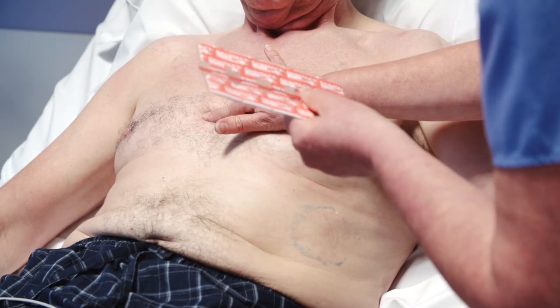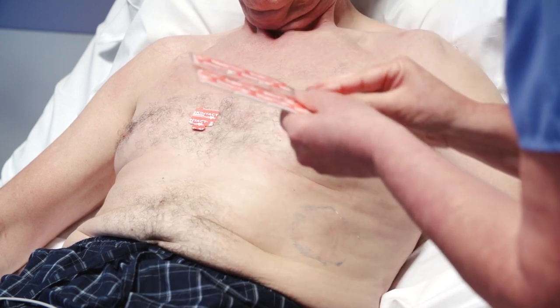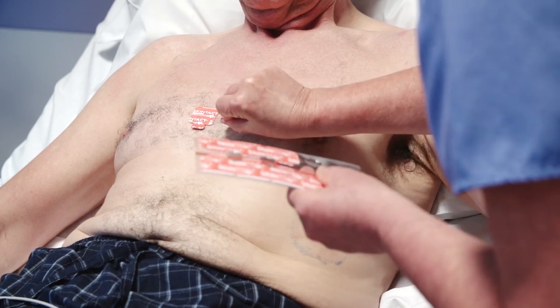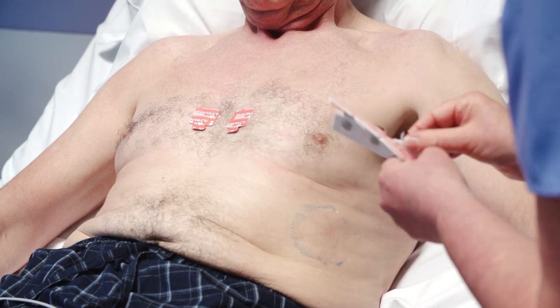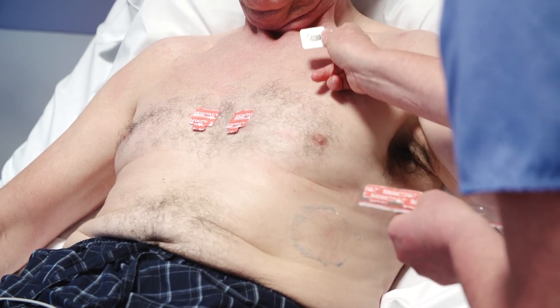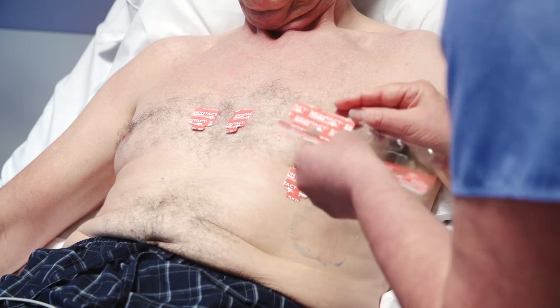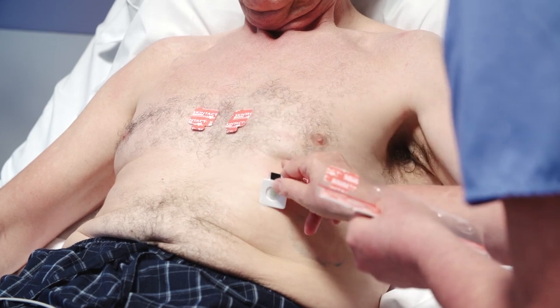V1 is placed in the 4th intercostal space close to the right sternal border. V2 is placed in the 4th intercostal space on the left sternal border. V4 is placed in the midclavicular line in the 5th intercostal space. V3 is placed midway between V2 and V4.